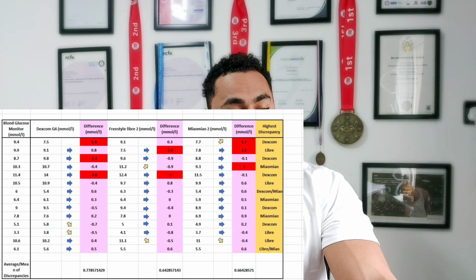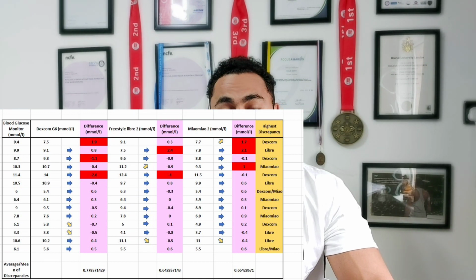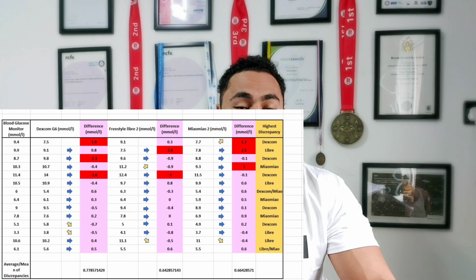Remember, these gadgets, they don't measure your blood sugar from the blood. They measure it from the interstitial fluid between the skin and the blood, okay? So there will be always a delay regardless. We all know this already. In terms of accuracy, you saw the table. I will put it right here so you can see what I see. I think that the difference isn't huge at all between all of them compared to the blood glucose monitor, and also between all of them compared to each other.